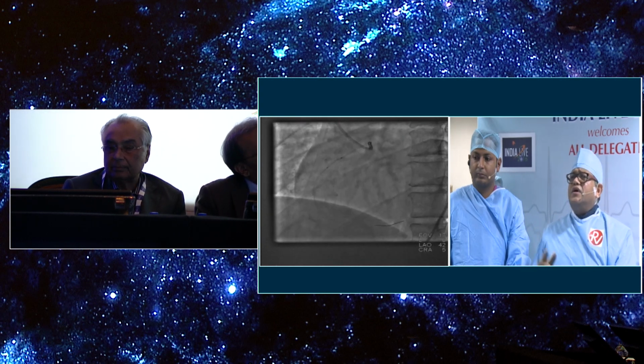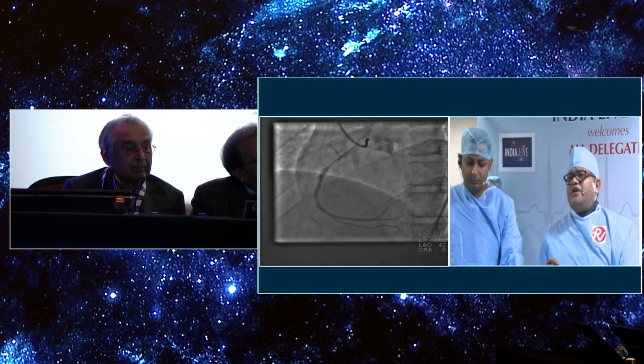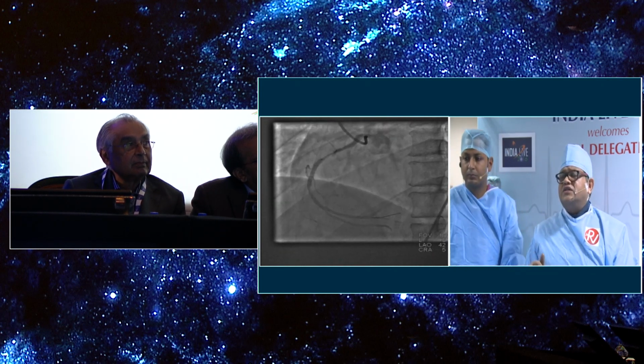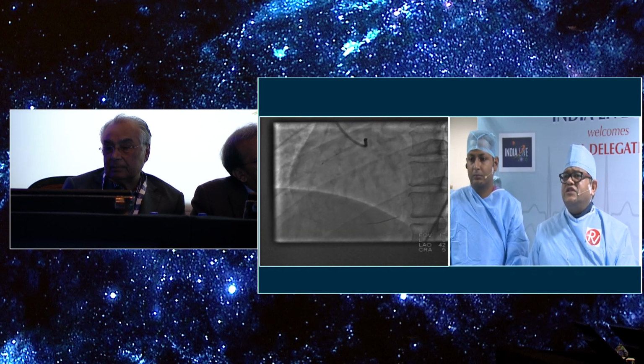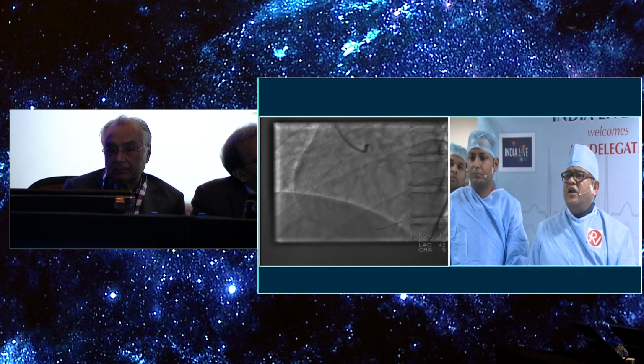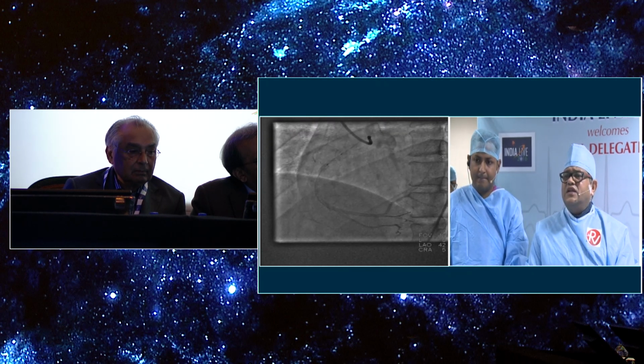That's right. Type A and B is the one where there is a risk of left coronary ostial dissection. But here, this type of RCA, which is type C, I think I am comfortable enough to use the AL1 guide. Let me dilate the distal lesion as well.